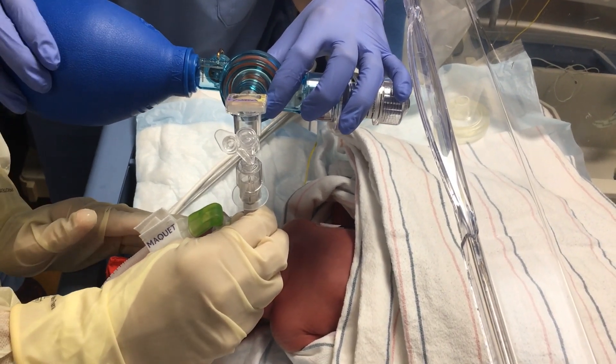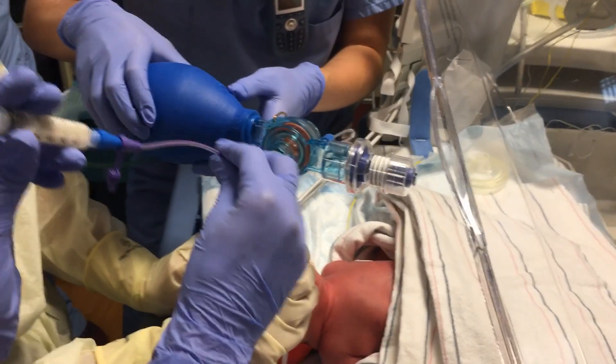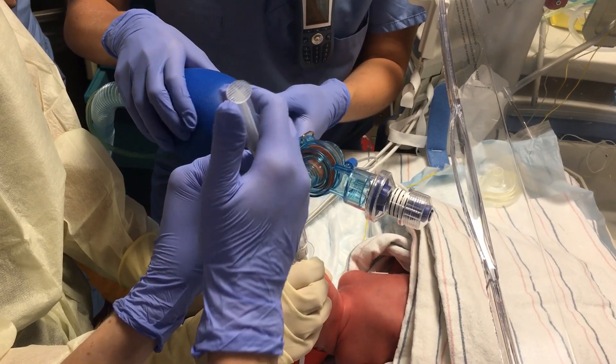Okay, we can insert the... go ahead now. Looks like our heart rate's 130. Sats are anything. I'm going to do a 2 ml aliquot. Okay. All right, and then sats are 100, heart rate's great.